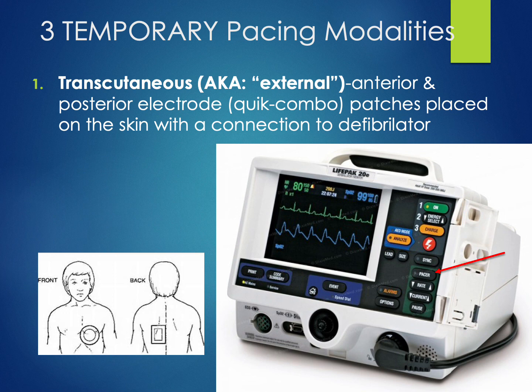So is this sustainable? Think about that. Do we want this patient to basically be hooked up to a defibrillator on the code cart indefinitely? No, this is again temporary, and this is an emergency situation. So as we're doing this, we're consulting with our healthcare team to get this patient a more sustainable intervention and to start brainstorming why is this going on and what else can we be doing.